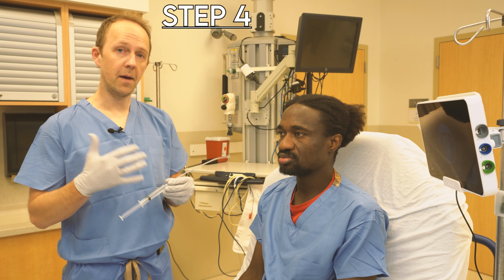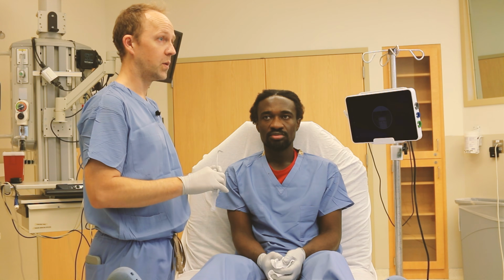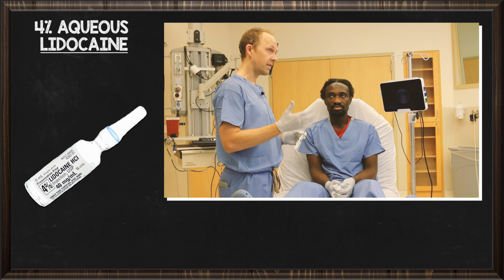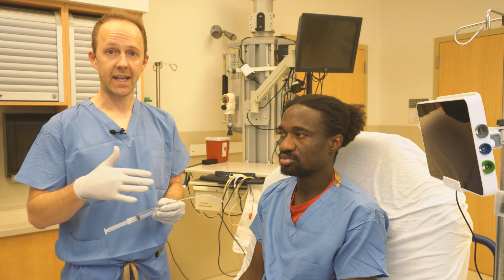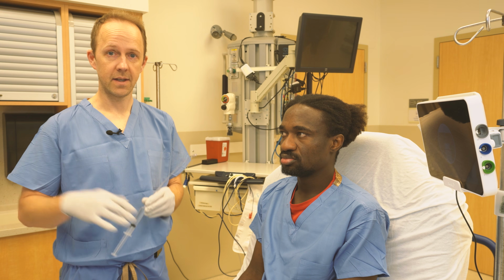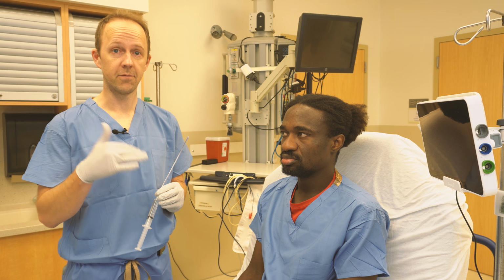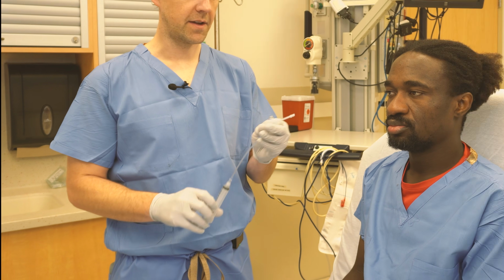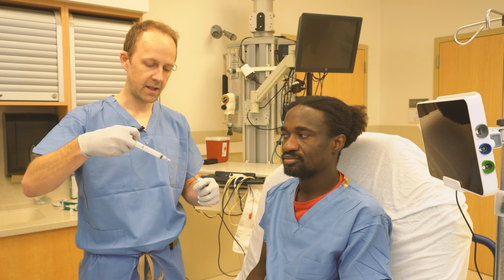So the next step is to numb the back of the throat, the base of the tongue, the epiglottis, the perilaryngeal structures. We like to use 4% aqueous lidocaine for that. We already used 5 grams in the nose, and anyone more than 67 kilos can get up to 15 mLs or grams of 4% lidocaine. So that means we have 10 more available to use here. We're not going to use all 10, maybe use 2 or 3 here, and then save some for the scope afterwards. And we also use this flexible atomizer. This is called the magic atomizer. And you can just draw it up straight up using the atomizer.